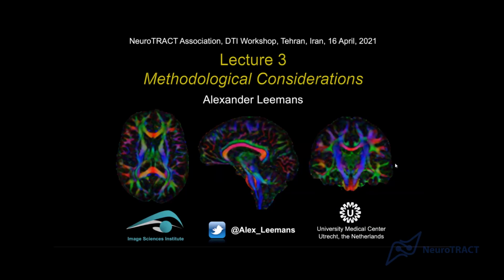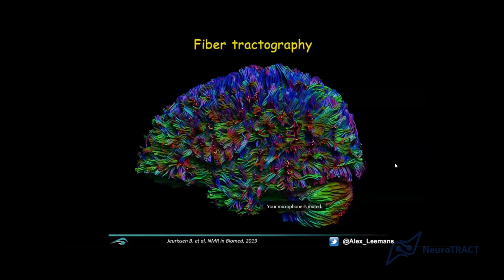All right. So fiber tractography. Here, what you see is a whole brain fiber tractography result. Looks very kind of like a coral reef or like some weird sea creature thingy. But obviously, these are all pathways reconstructed with tractography. And again, color information is about orientation.